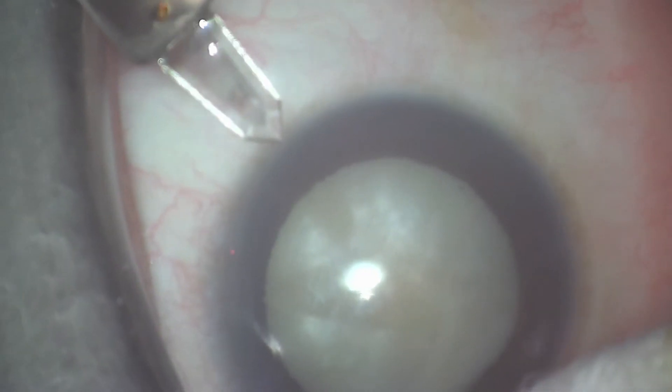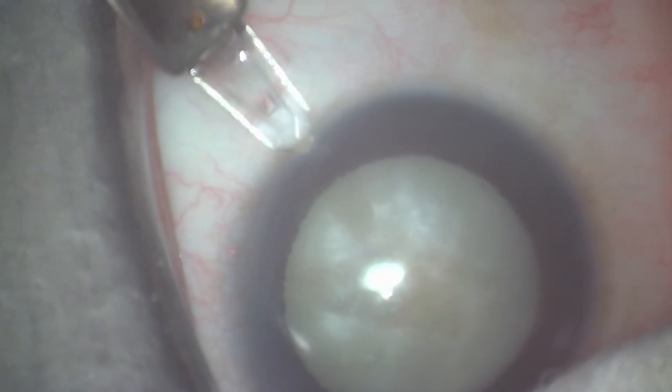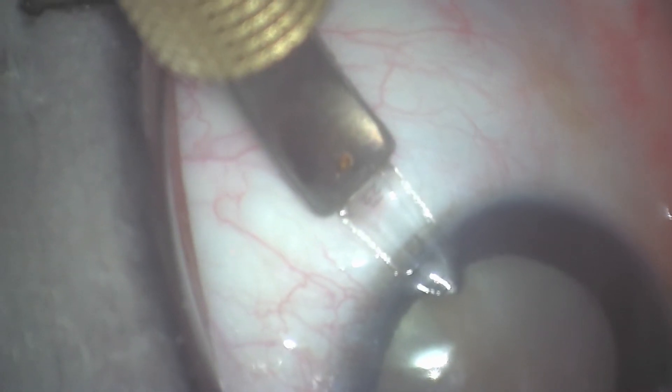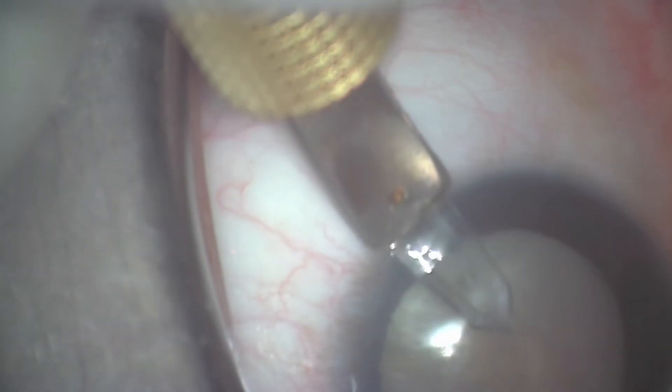This is Dr. Jonathan Franz from Fort Myers, Florida, discussing the successful management of the white cataract. This is a patient that had hand motion vision preoperatively and had had a cataract for many years.